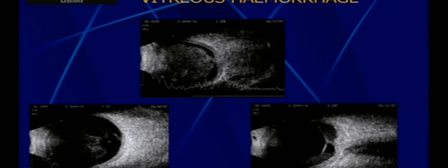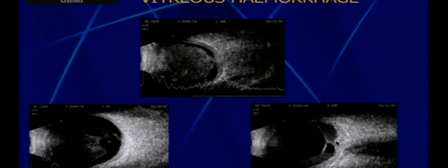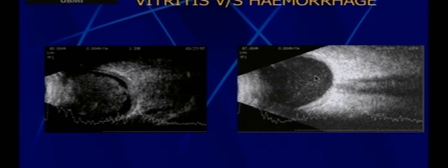Vitreous hemorrhage can be graded on ultrasound. Early hemorrhage shows discrete mobile echoes. As hemorrhage organizes, it looks like a mass — at that stage intervention is likely required. Most important is identifying the attachments of any membrane, particularly over the optic nerve and macula. If the vitreous membrane is attached to and lifting the macula, the prognosis is poor. Additionally, ultrasound cannot differentiate hemorrhage from inflammation on its own — clinical correlation is mandatory. In very early hemorrhage or inflammation (within first 24 hours), the scan may appear normal because early echoes have the same echogenicity as vitreous — no acoustic interface, no signal. Therefore, always scan at high gain settings (80–87%) before declaring the vitreous normal.